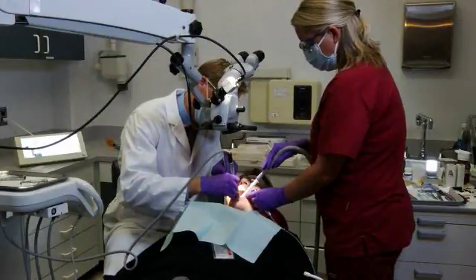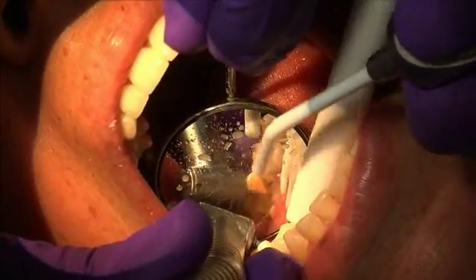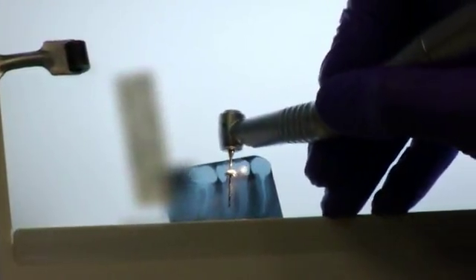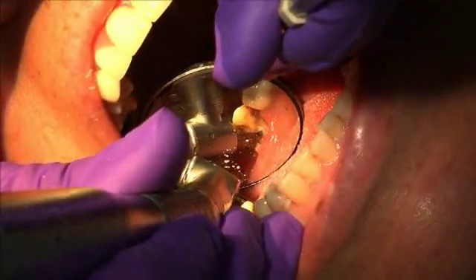Select the universal drill to remove root filling. Leave a minimum of 4 mm of filling apically. Select the post size and matching drill, then use the appropriate drill to widen and shape the root canal.